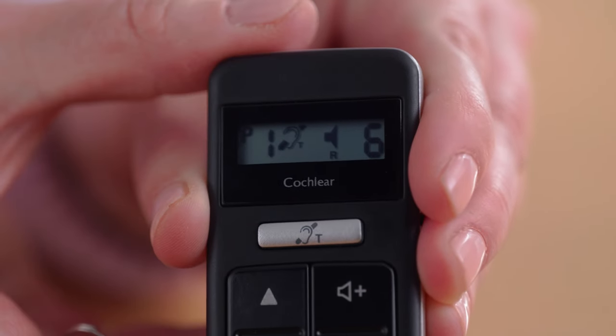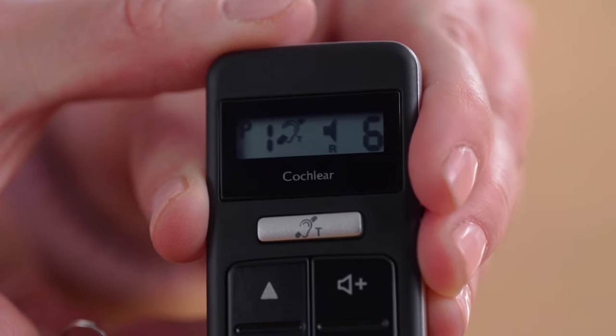If telecoil is a feature your audiologist has enabled on your sound processor, you can activate it with a short press of the silver button and the telecoil icon will appear. To turn it off, quick press again.